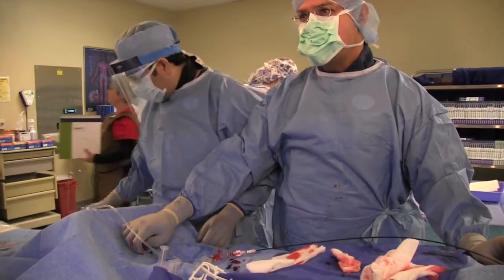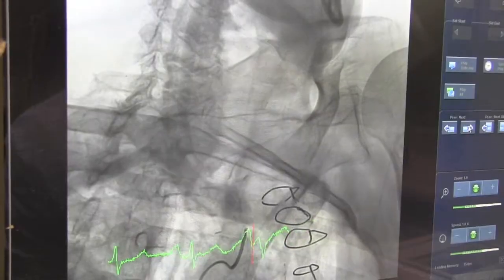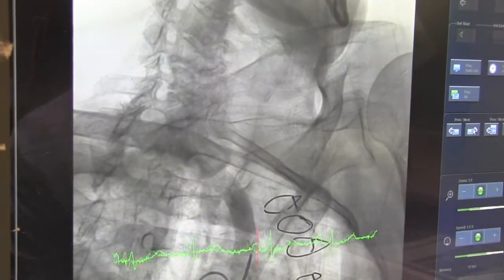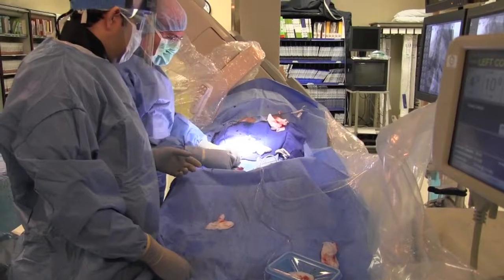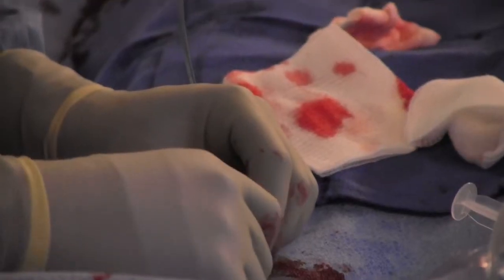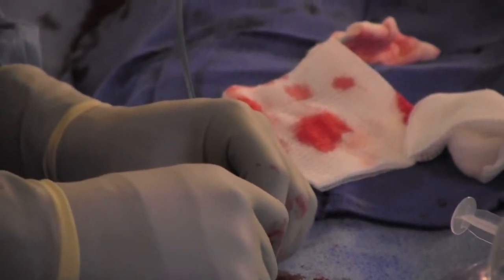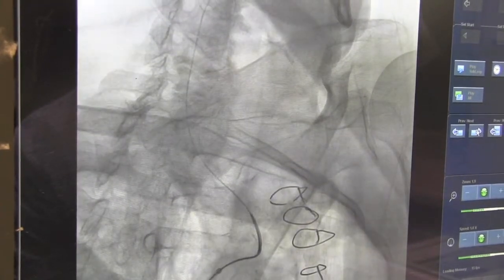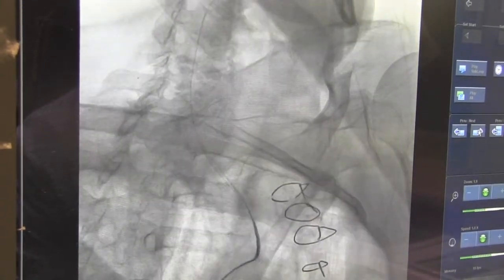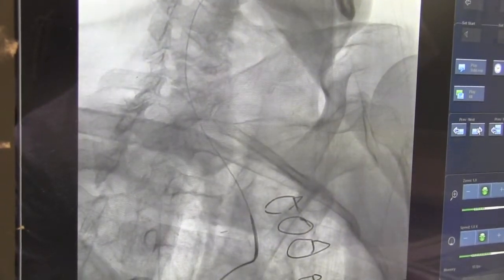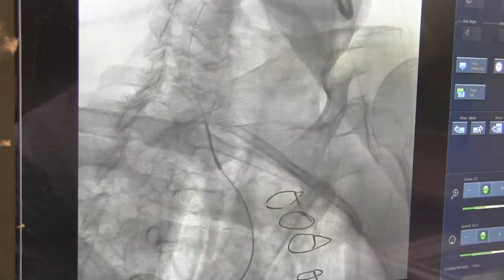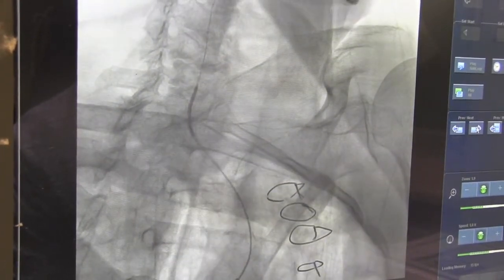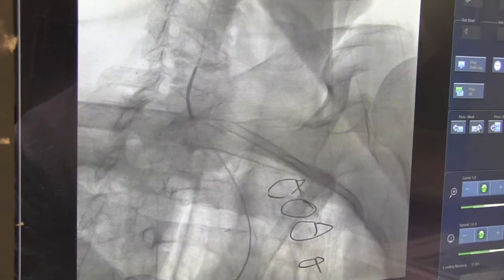Here we're performing an angiogram to confirm the position of our catheter in the brachiocephalic artery. We've then advanced a wire up the brachiocephalic artery into the right external carotid artery, and over this wire we will advance our system — the JB2 catheter being advanced into the right common carotid artery.